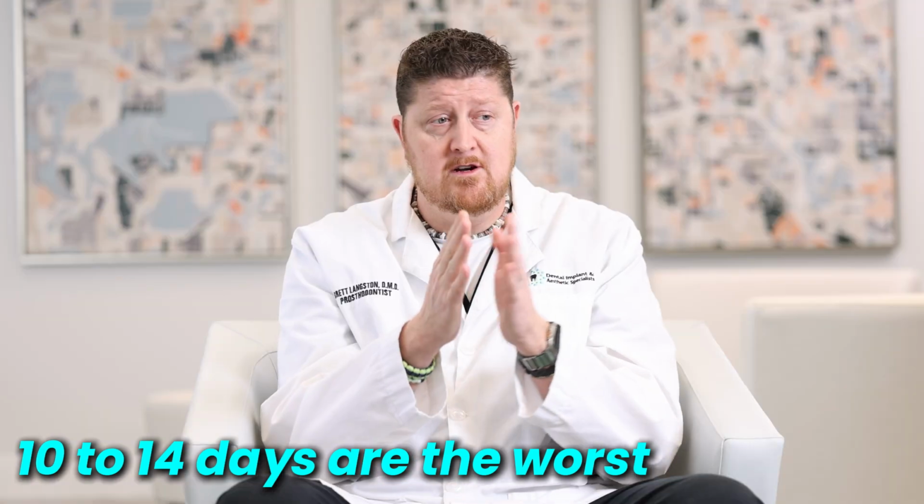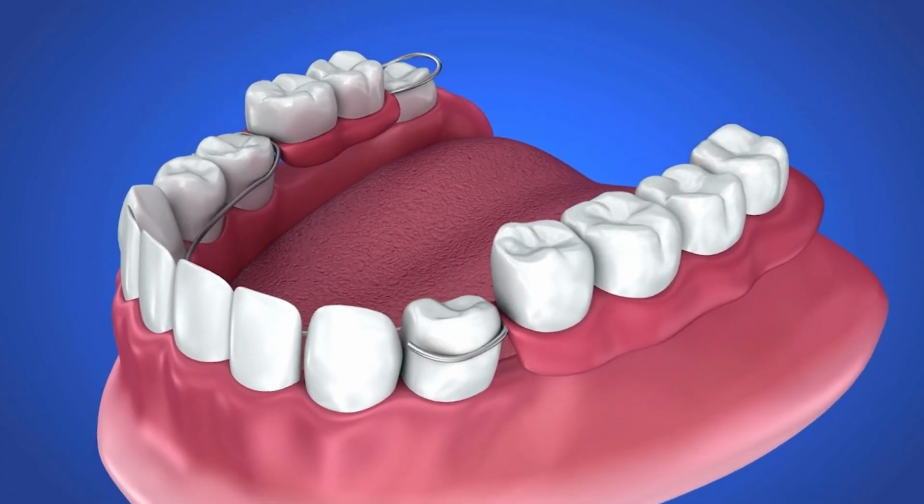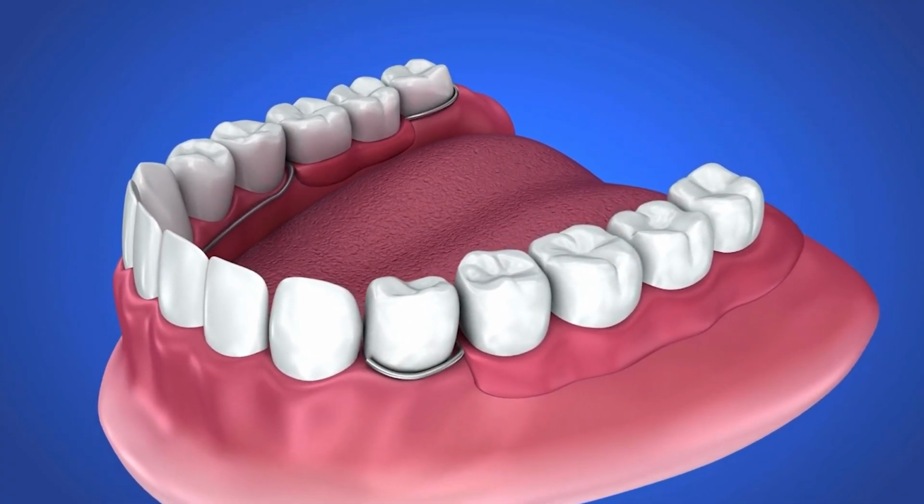Through this process of healing, what I always tell patients is the first 10 to 14 days are the worst, because you're going from having teeth to not having teeth. You've got this strange new appliance in your mouth. It's going to feel big. It's going to feel bulky. There's definitely some getting used to, because to be honest, you really have to train yourself how to eat again. You have to train yourself how to talk. You have to train yourself how to function with these new appliances in your mouth.